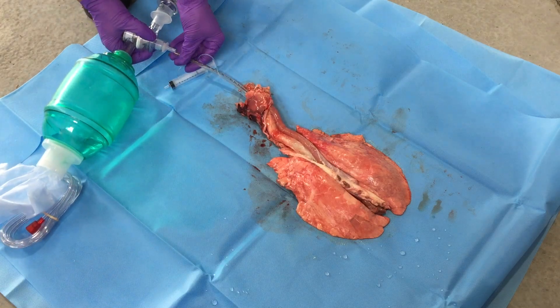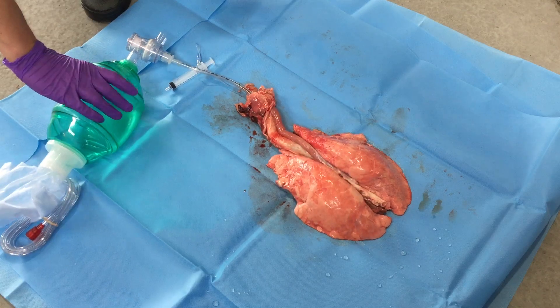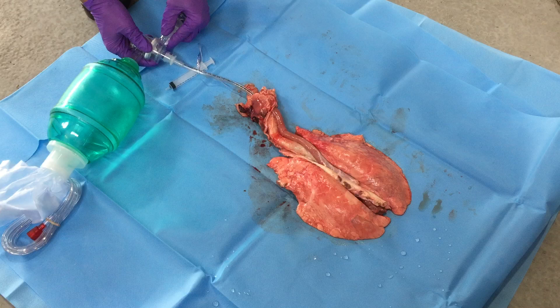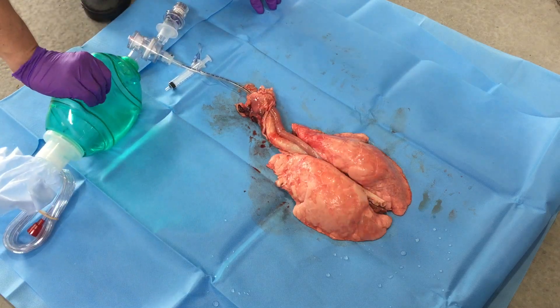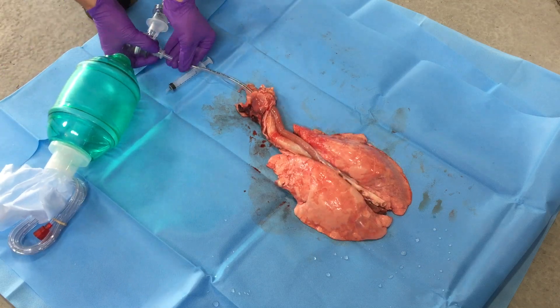So again: ventilating without a PEEP valve, then ventilating with a PEEP valve at 10, and then removing them from PEEP.